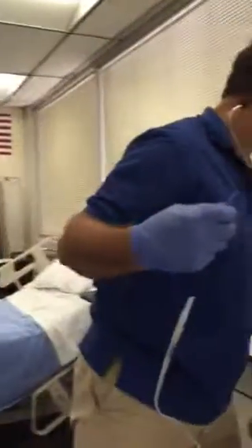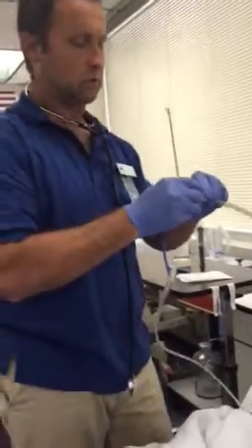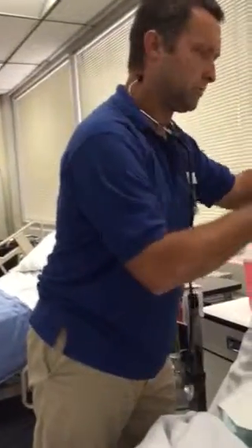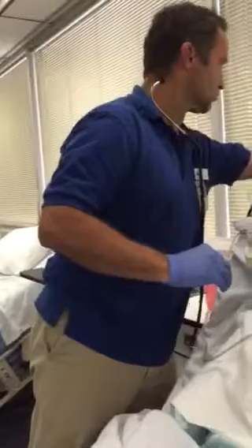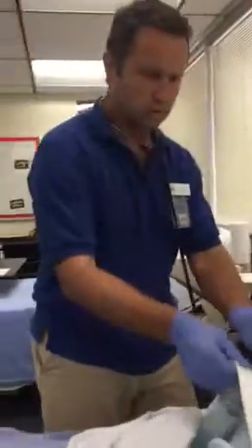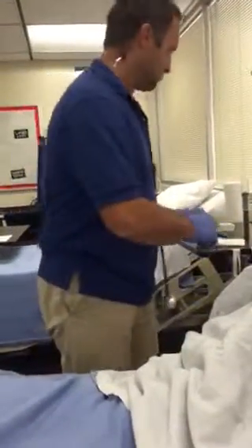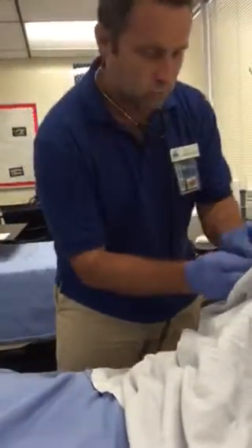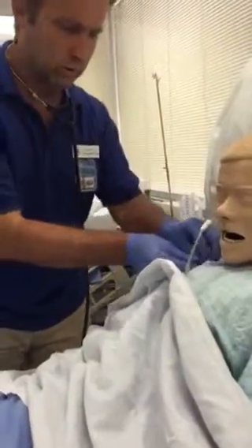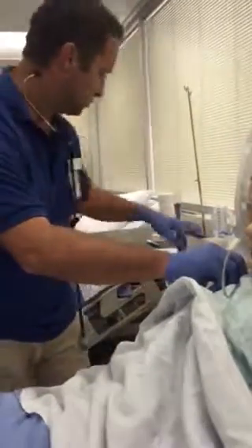I'm going to sit this here temporarily. I'm going to take my NG tube and apply it to the suction. We're going to set the machine to intermittent suction. I'm going to take my rubber band and my clothespin. A rubber band around there, a little slip knot. I'm going to clothespin this to his little gown with enough room so he can tilt his head, move all around, and he won't tug on his NG tube.